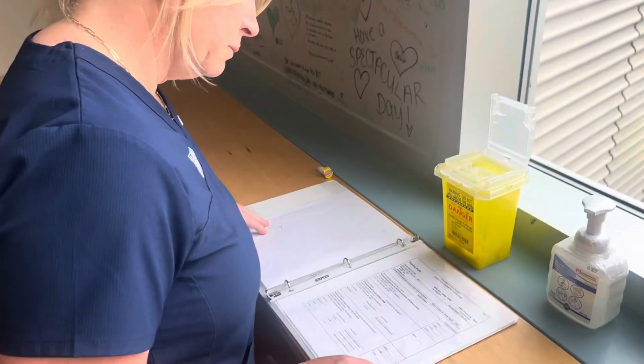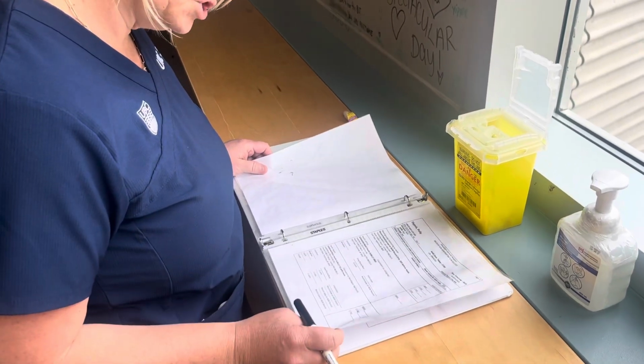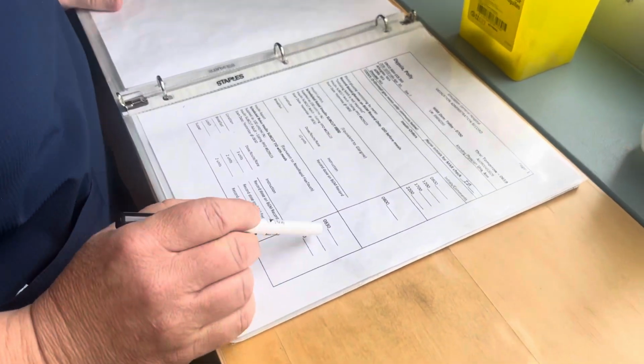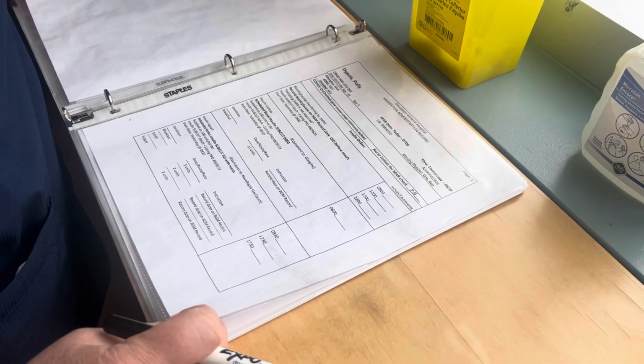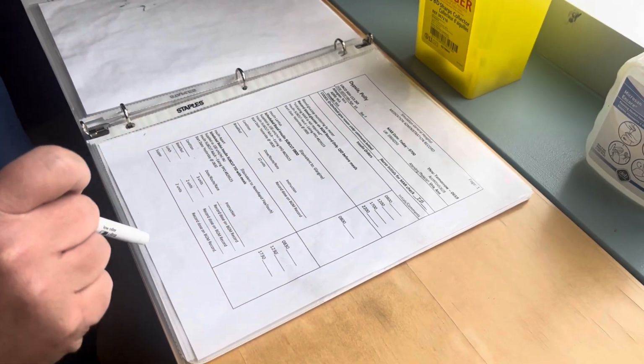Check the MAR to see what my patient, Polydipsia, has for lunchtime meds. So it looks like 12:30. Polly is due for her aspart insulin. Just checking the MAR, we've got no allergies, so that's good.